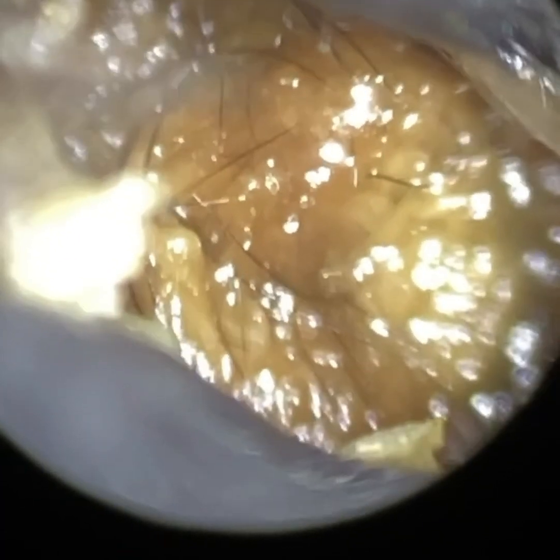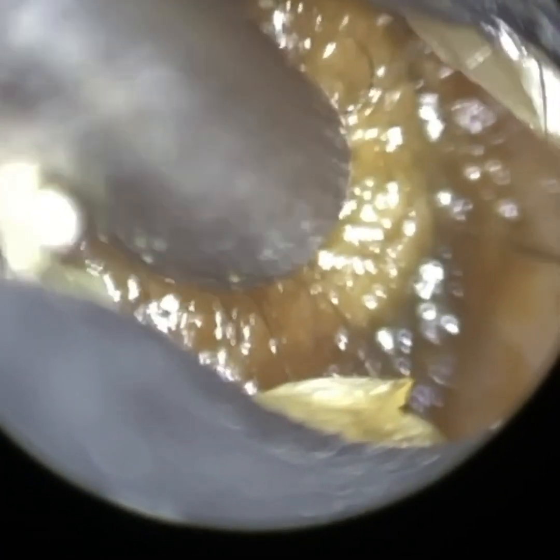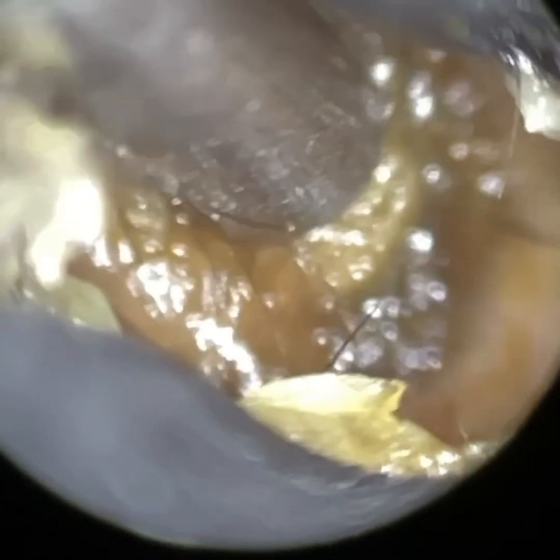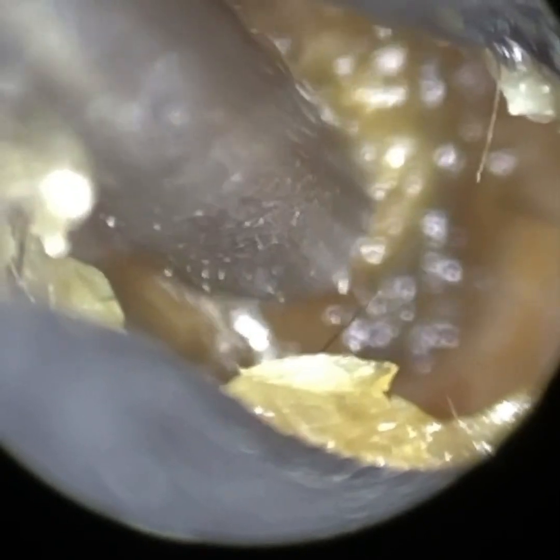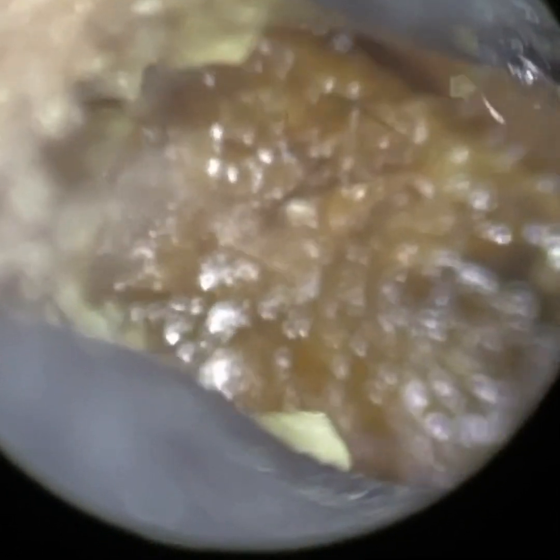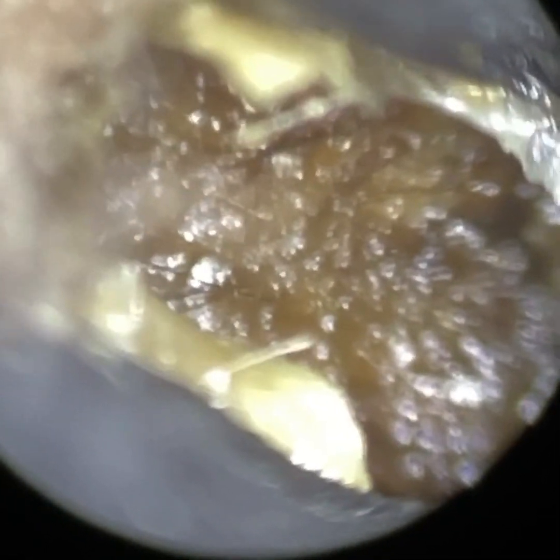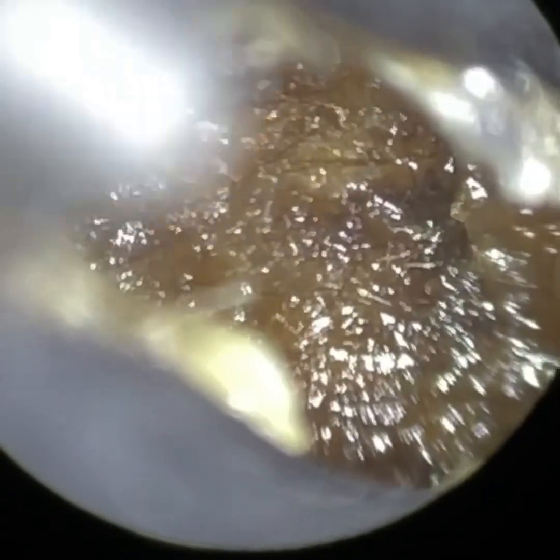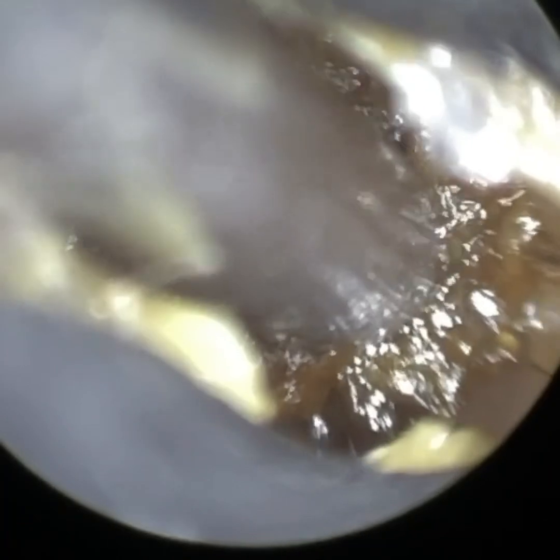We had a client here attend with bilateral fully occluding earwax, and we're using, I believe, the 4.25mm speculum to dilate the ear canal open. They have got quite a narrow entrance, and you can see there we've just got the wax and dry skin plugs in focus. You can see there's some peripheral dead skin, so we've just got the main body of wax a bit further in focus.